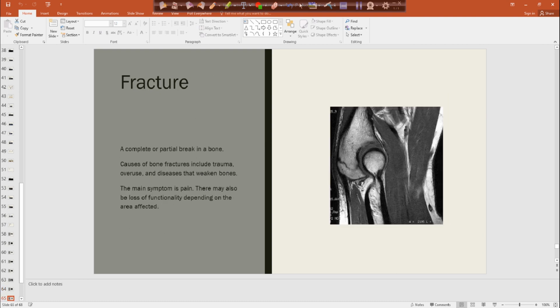And then just a fracture. Our STIR, or T2 fat sat weighted images, are going to give us our best contrast and noise when we're trying to delineate a fracture. Here's that fracture of the olecranon process. Obviously, most of the time we can see these on x-ray, but if it's a hairline fracture or stress fracture, you might need to have MRI imaging of that particular body part.